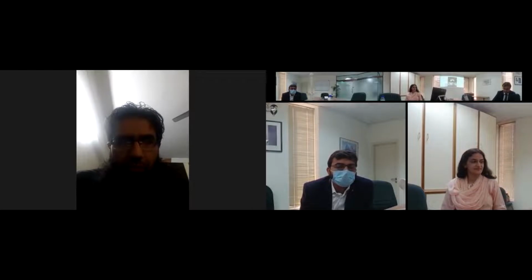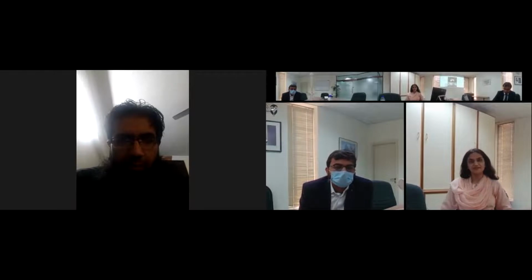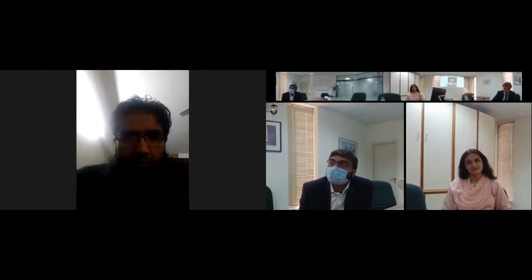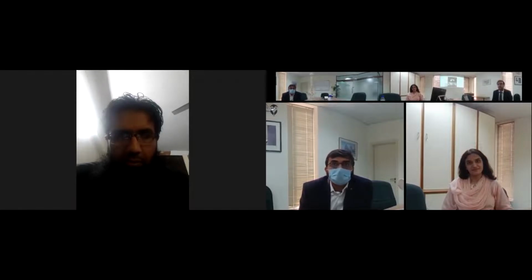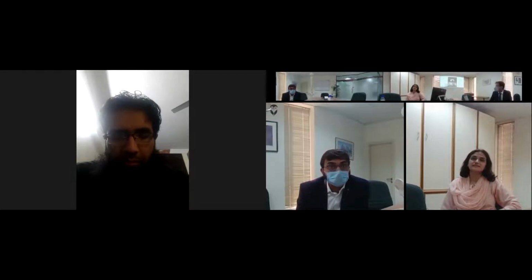Just regarding the CTs, as an interventionalist, there are pros and cons if you compare the CT scan with the fluoroscopy. As Dr. Zahid Wahid has mentioned in his talk about the evidence in relation to CT, superiority presumptively, as compared to the fluoroscopy, there is no evidence there. But surely, as Dr. Rayan said, there are axial images that you can see. I have done the celiac under CT guidance. It's far superior in relation to watching your needle tip and the relevant structures.